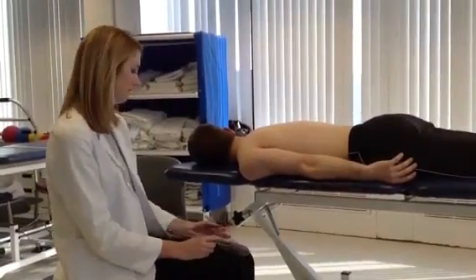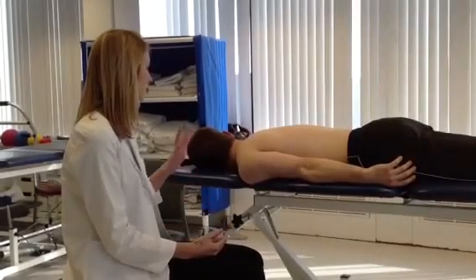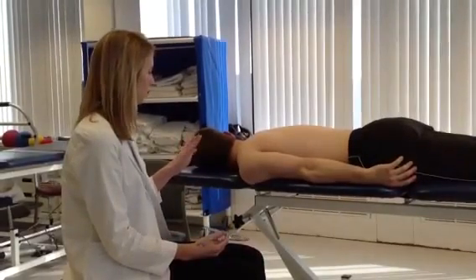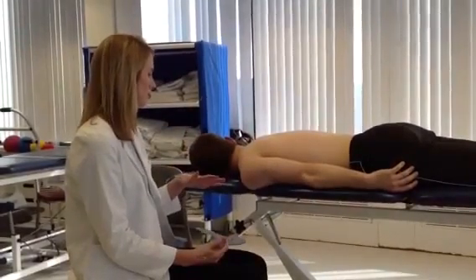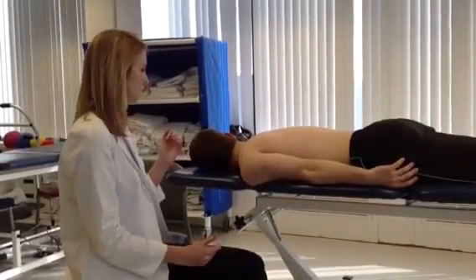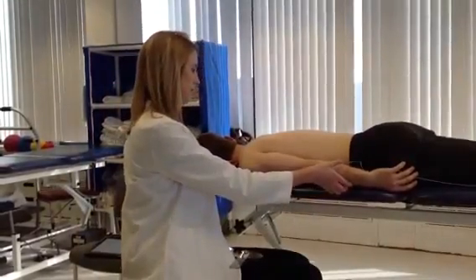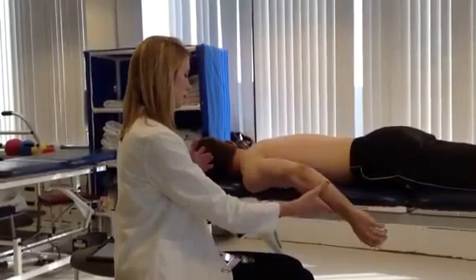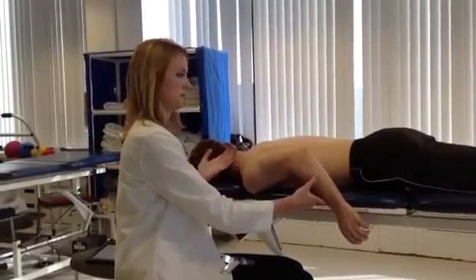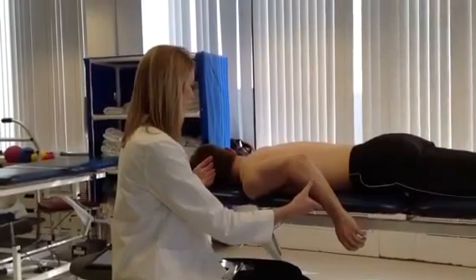Alright, Steve, so now that I've got you in the correct position on your stomach with your head facing away and your palm facing your side, I'm going to have you extend your shoulder. So you can go ahead and take your arm off the table, and you can bend your elbow as much as you like during this motion, because we don't want the biceps tendon to limit any motion in this direction.